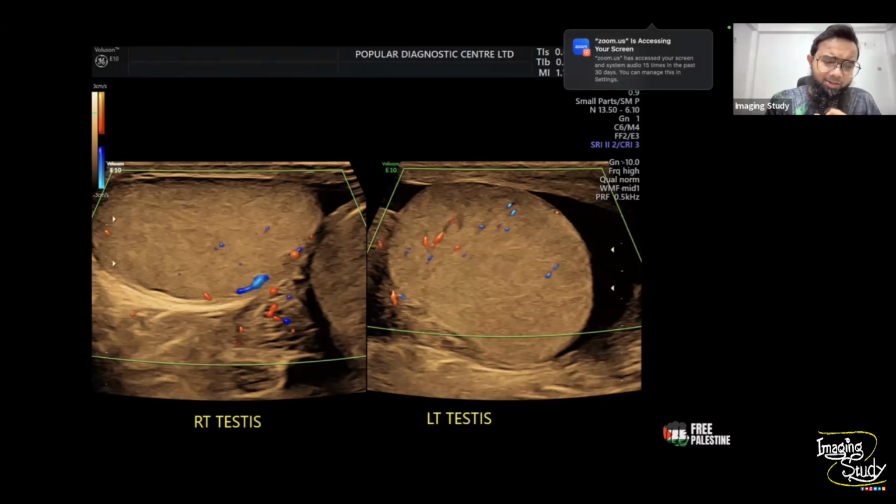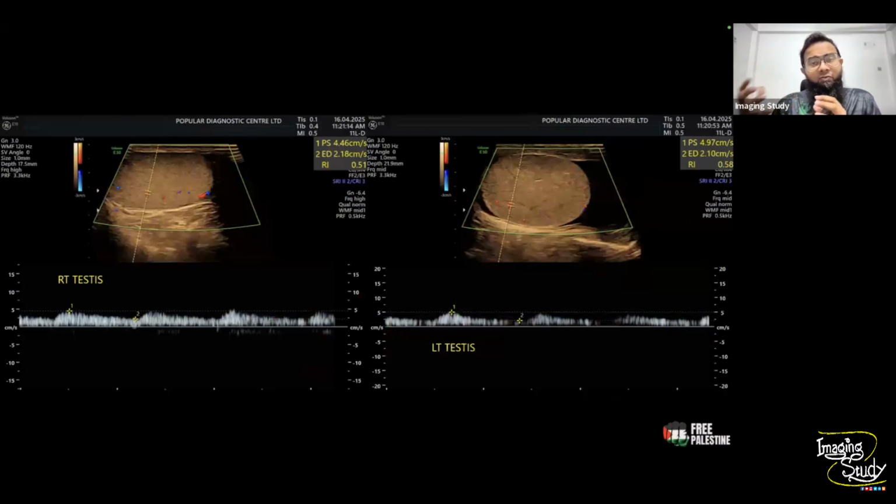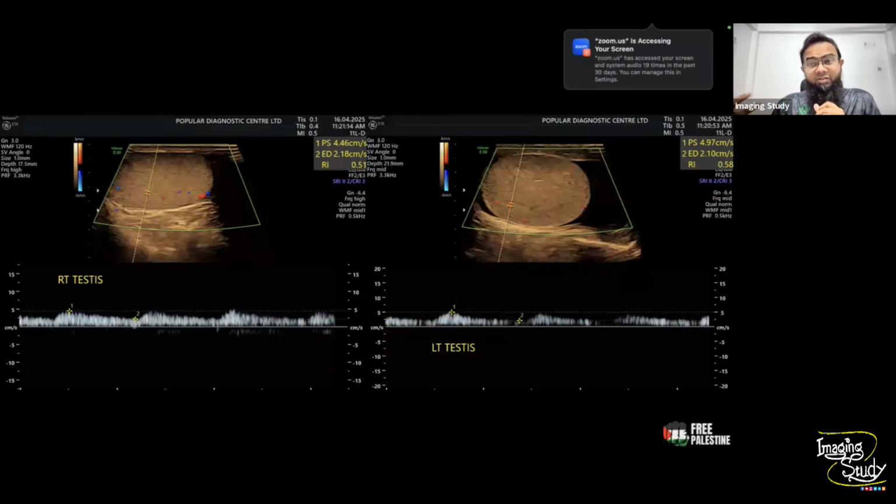We are not satisfied, so we want to do some pulse wave checking. We took a sample from the intratesticular tiny vessels. Both are showing the arterial wave pattern. You can see some diastolic flows. In case of torsion, you may get flow from the cremasteric or deferential arteries, but those arteries or their branches usually won't show any diastolic component.